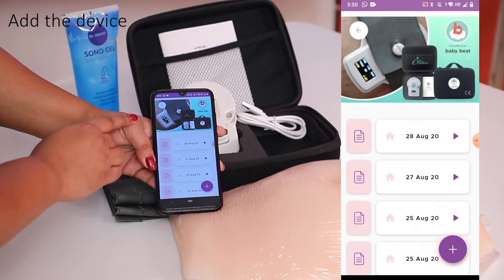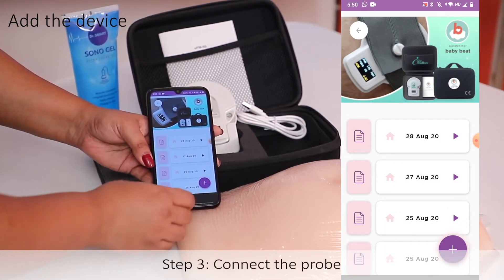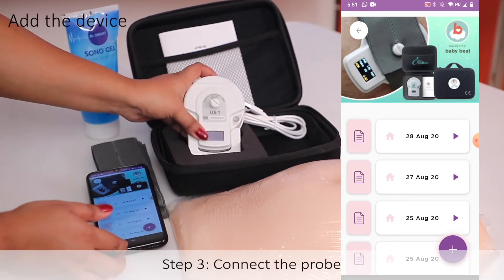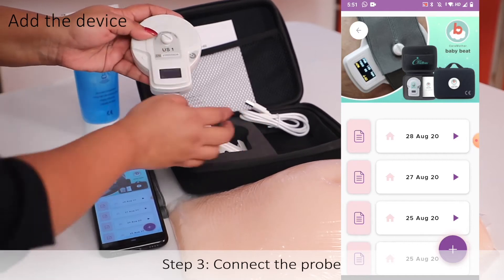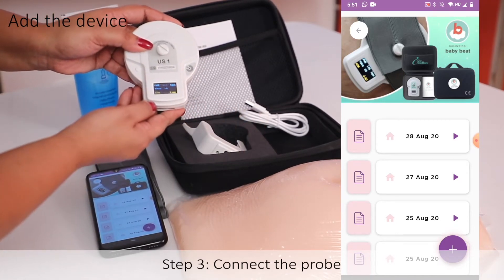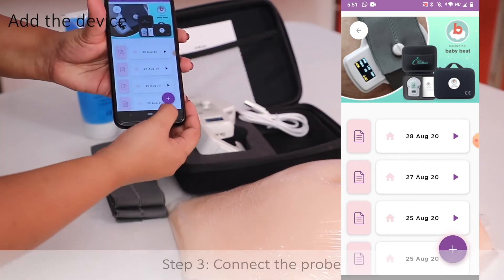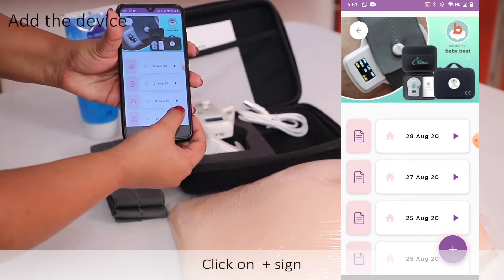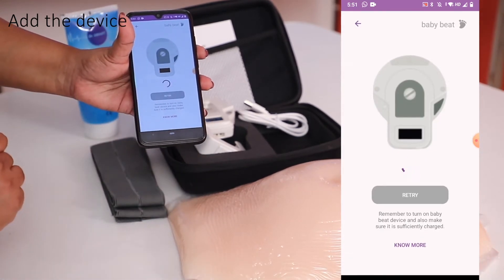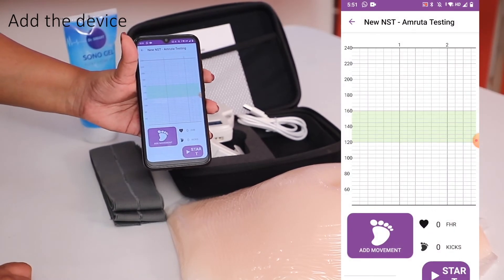Click on this. At this stage, you will have to connect the Doppler to the app. To do that, take the Doppler, take out the charging pod, and switch it on with a long press on the side button. The screen comes alive. Then come over here and click on the plus sign in the app. It will start reading the device. Once it has found the device, it will take you to the test screen.